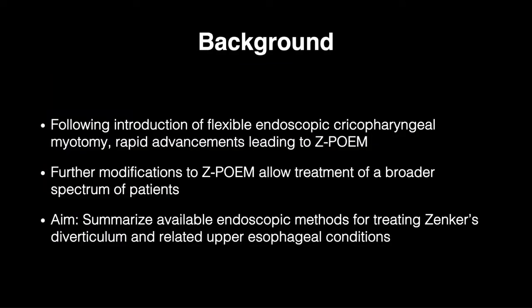Following introduction of the flexible endoscopic cricopharyngeal myotomy, rapid advancements in endoscopy have led to the Zenker's per-oral endoscopic myotomy and associated modifications, allowing treatment of a broader spectrum of patients. We will summarize the available endoscopic methods for treating Zenker's diverticulum and related conditions.